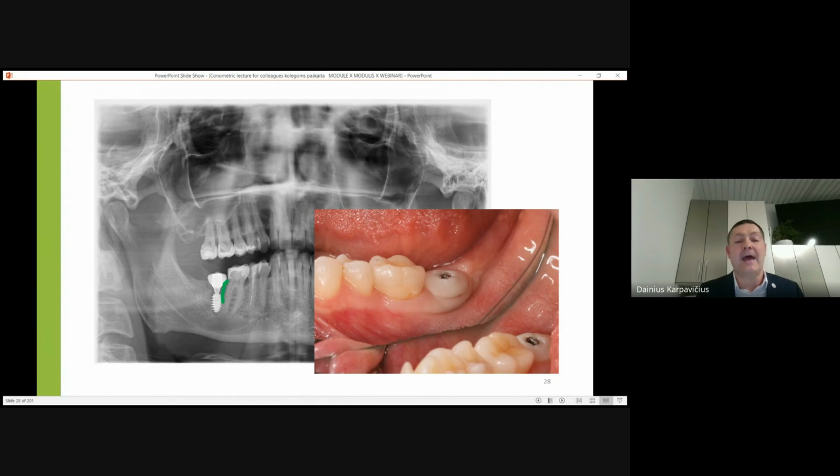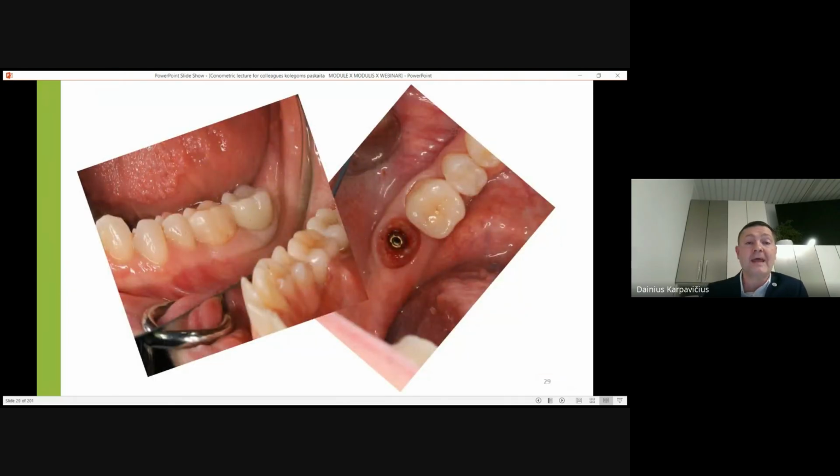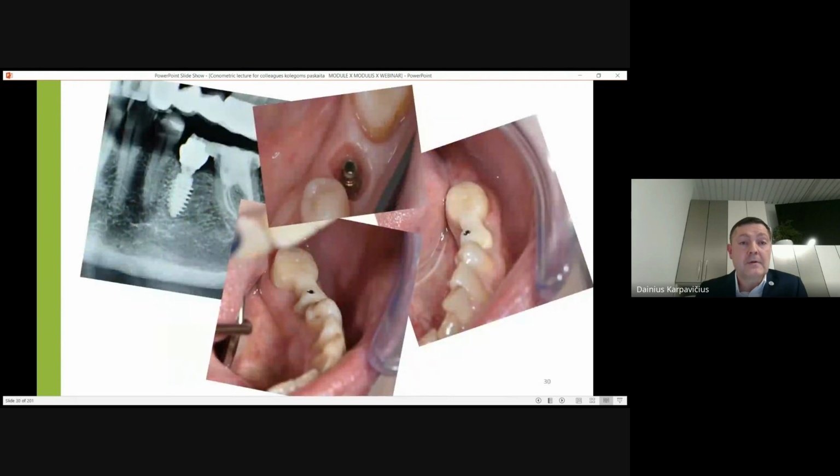Take again the geometry of our later prosthetic outcome from the implant. It is quite natural, because if our implant is more upper, the emergence profile will be very sharp and it will be like a balcony. For these cases, especially the molar area, it's not very nice, and sometimes it might cause the beginning of peri-implant tissue problems. So this is again after a couple of months.